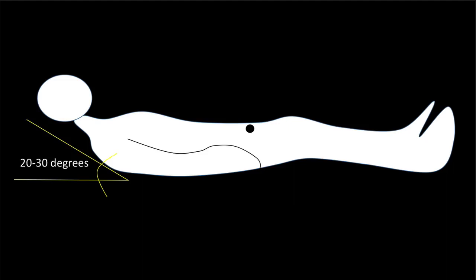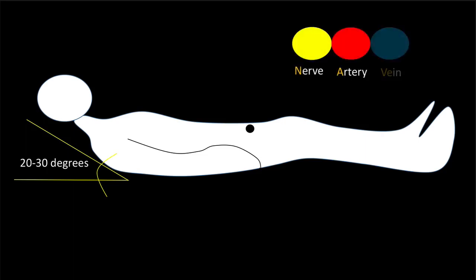This is to promote venous pooling in the legs. The leg is rotated externally and the knee flexed, and then you identify the common femoral vein, which is going to be medial to the common femoral artery, in the groin near the crease in the thigh. So remember it's nerve, artery, vein, lymphatics, going towards the navel. That's the way that I remember it.